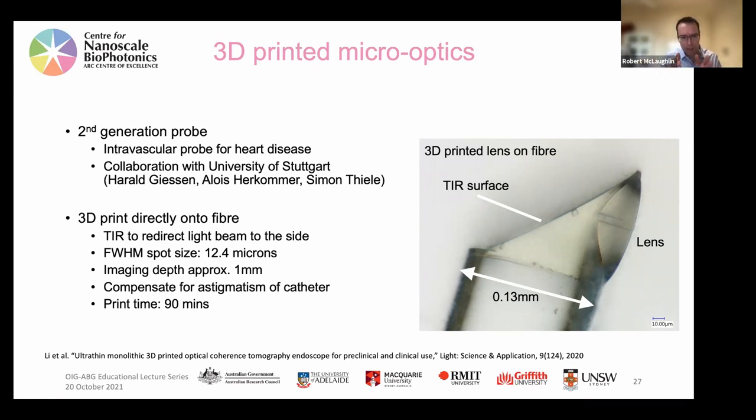So just to geek out for a second, there's a particular noise in OCT called speckle, which is these grainy, dark and bright bits. In OCT, the speckle is often considered noise, but actually it's not, it has information. Statistically, the speckle has a very particular size, which is set by the optics. So if I stab a needle into some muscle, by analyzing the speckle, I can actually work out how fast the needle was moving.